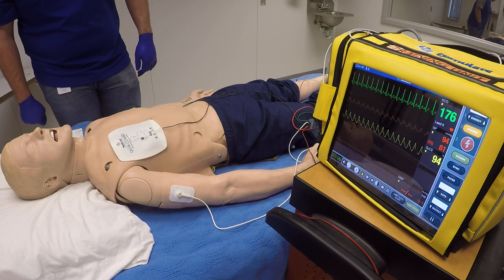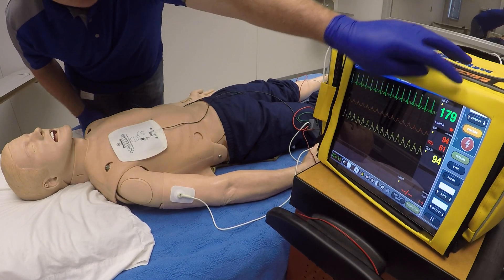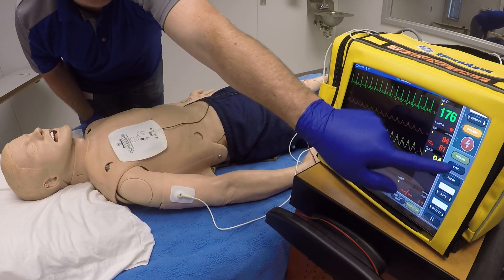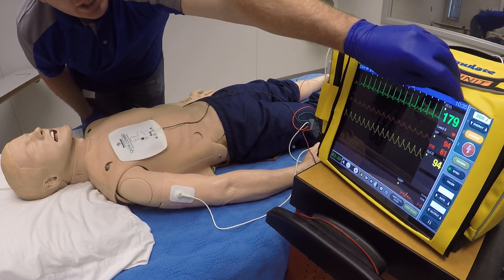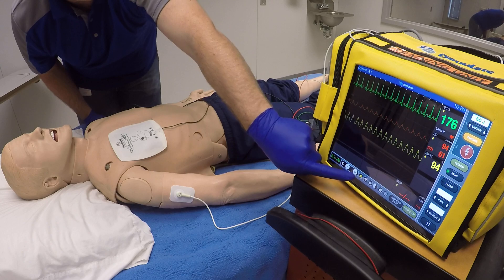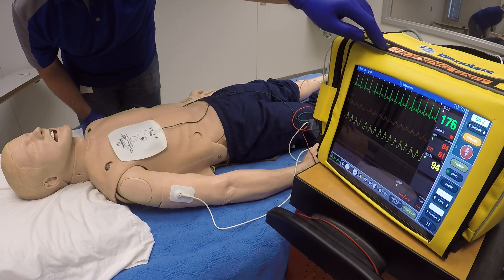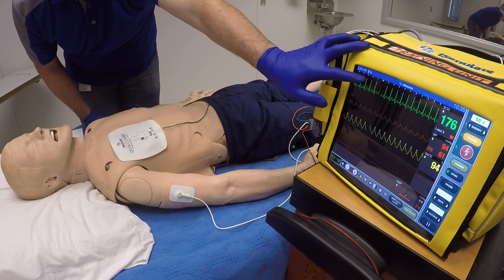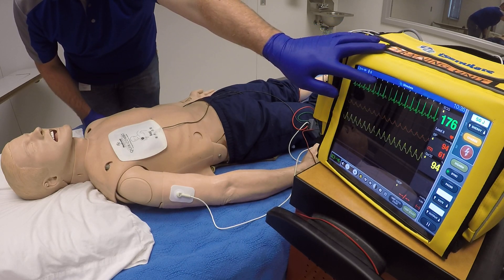We've determined the need to go ahead and synchronized cardiovert. We'll activate the synchronizer mode — on this model, similar to a LifePak, you'll hit the synchronize button. Turn your energy down; it's set at 200, but follow ACLS protocol. Because the rhythm is regular and narrow, we're going to start at 50 joules. We're watching the monitor and we have our markers at the top of the ECG tracing showing it is synced up appropriately.